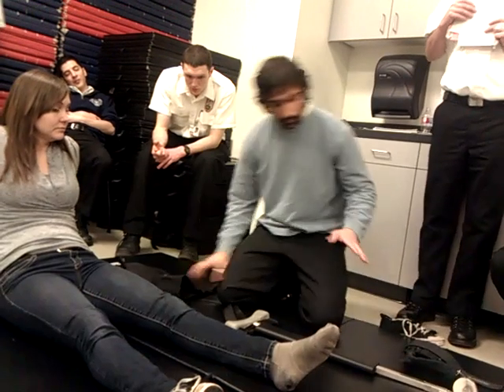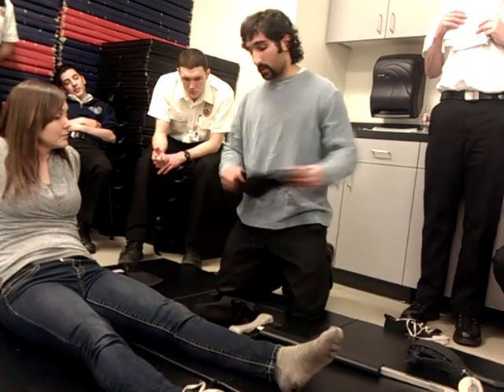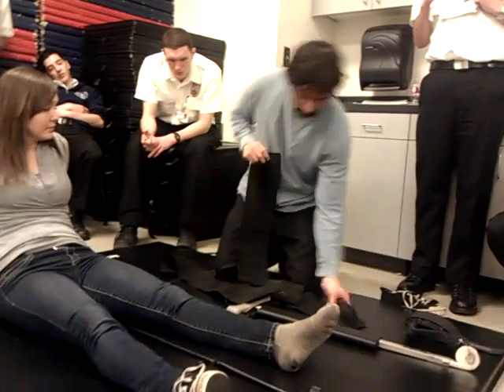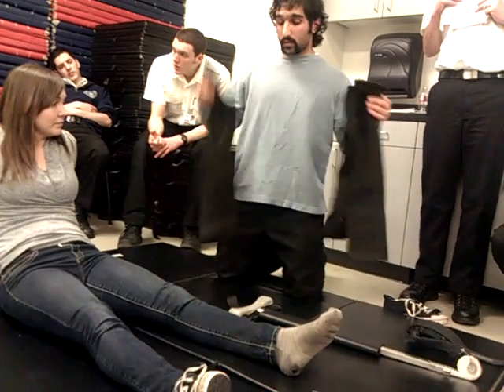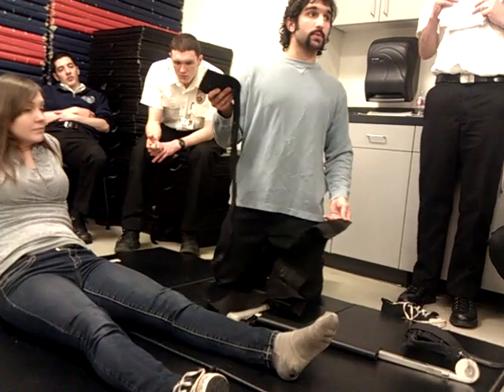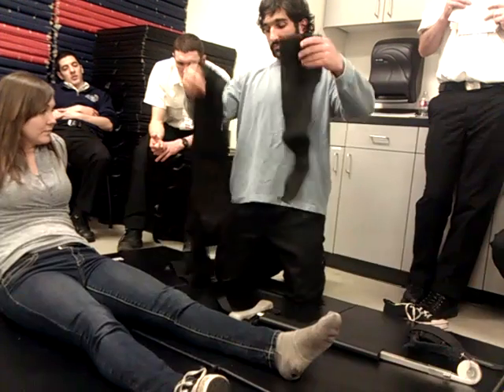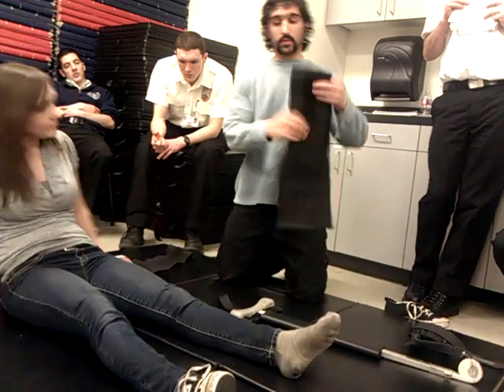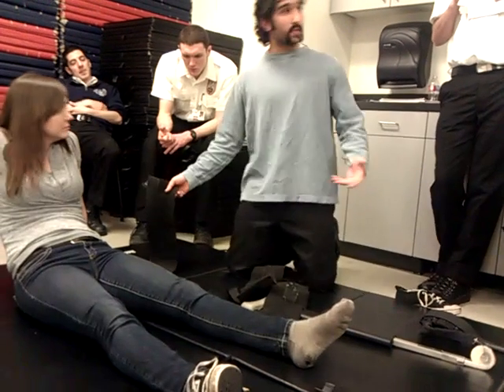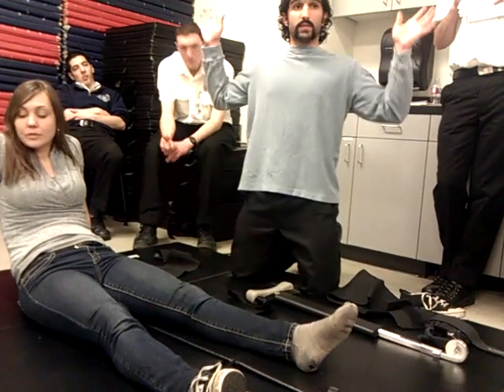I was going to mention something. I mentioned earlier, there's 3 straps. They're all different length straps, and that is also important. If the straps are going around the legs, where do you think the longer strap's going to go? Top. Exactly. These two, one just goes over the knee and one goes below the knee, but you always want to make sure you have the longer strap up top. Okay? So, the other side is being safe.